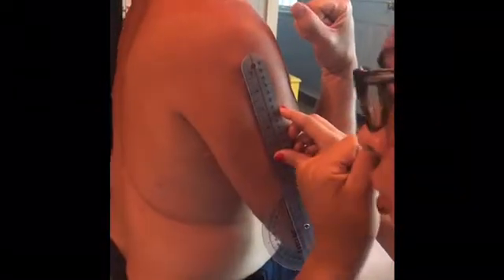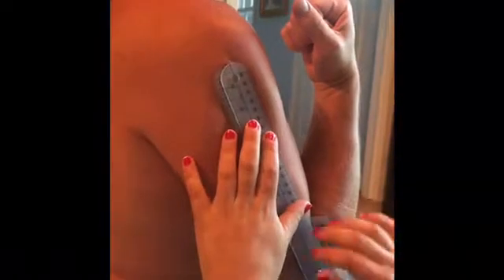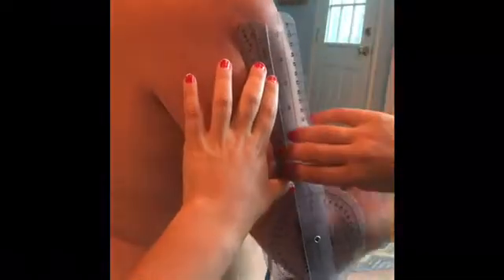We're going to be measuring elbow extension, and the typical range of motion is 140 to 0 degrees. You're going to start at the axis, the lateral epicondyle of the humerus. The moving arm is going to be midline of the radius, and the stable arm is going to be midline of the humerus. So you're in a flexed position. Now go ahead and straighten your arm out. And it is 0.